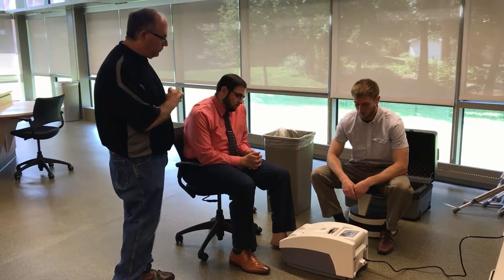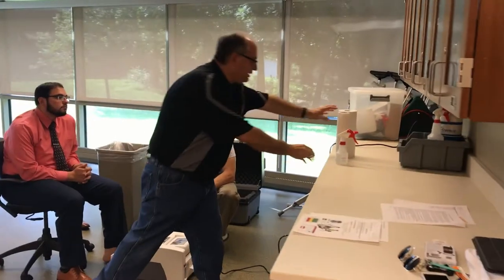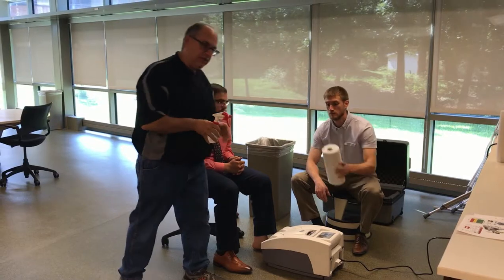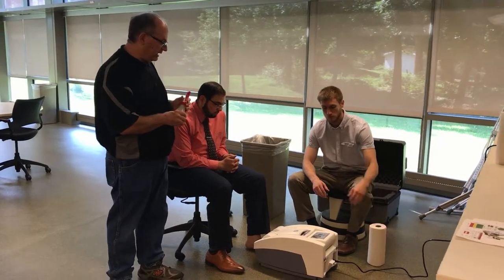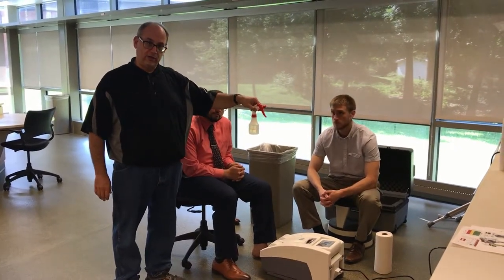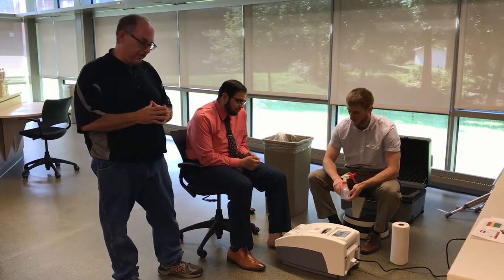What we're going to want to do is get our supplies ready. That includes having plenty of paper towel — this is rolled paper towel, but you can also just use sheets. There's going to be a lot of paper towel to dry off the machine and to give to the patient so they can clean off their ankle. You definitely need to have a spray bottle full of isopropyl alcohol. It takes a lot of alcohol sprayed on both the device and on the patient's ankle to get a good signal from the device.